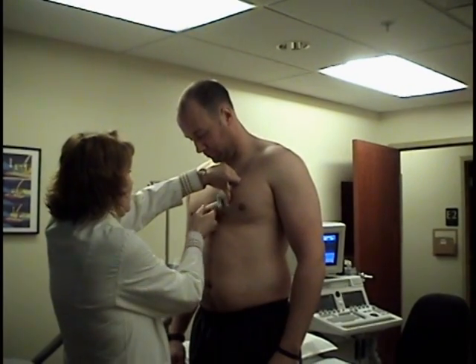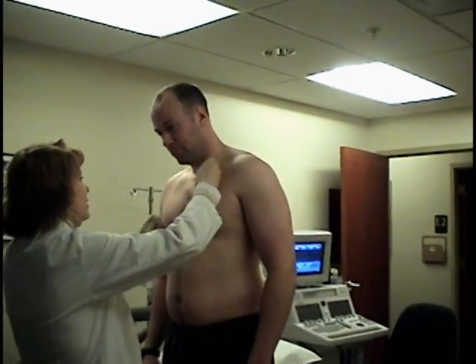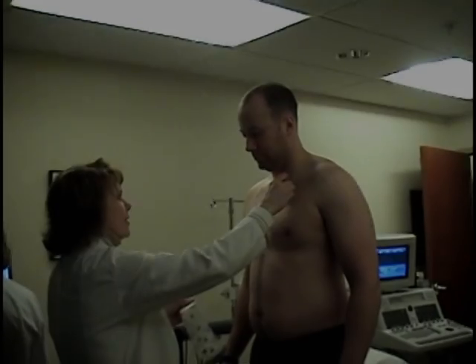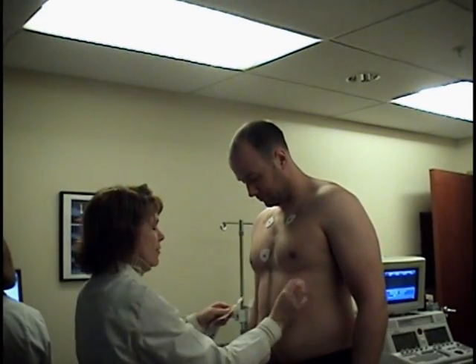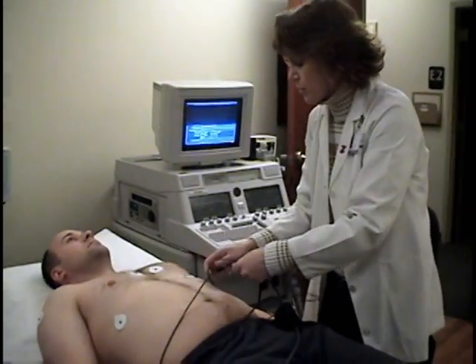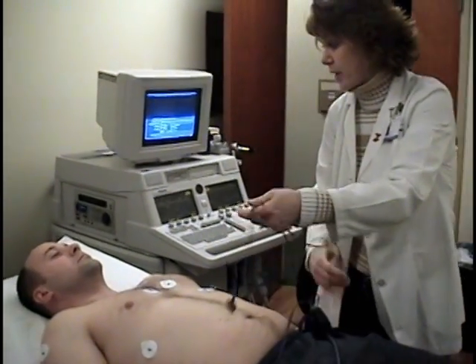If you are a male patient, it may be necessary to shave a portion of your chest. This ensures the proper connectivity of the electrodes to your chest. After the electrodes are in place, we will have you lie down and take a baseline EKG.